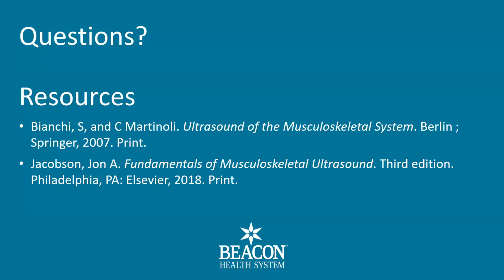And so people just getting started in ultrasound can make that decision how much they want to annotate or not annotate. A little picky thing, but again, a lot of people just getting started with ultrasound watch these, so I throw that out. Again, beautiful images of the Pes.